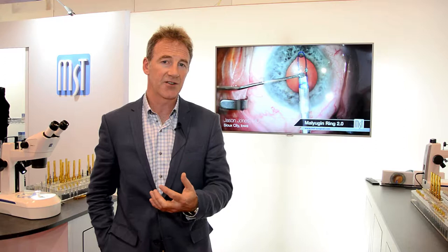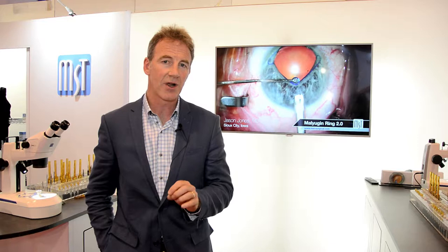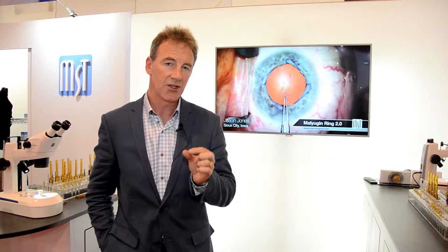We've got some model eyes made by simulated ocular surgery that can be used to mimic difficult cataract cases. We can create a zonular dialysis, we can create a small pupil and then we can train trainees how to use the implants, how to use the Malyugin ring and the capsule tension rings before they operate on a live patient. The capsule retractors are particularly helpful to practice beforehand.